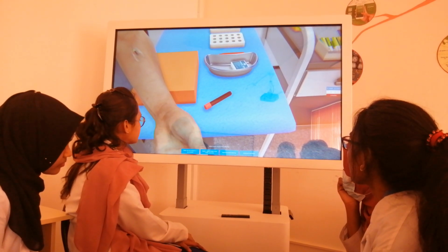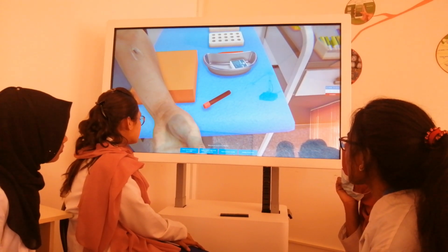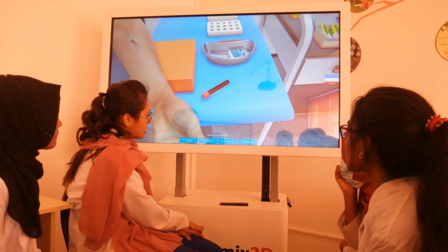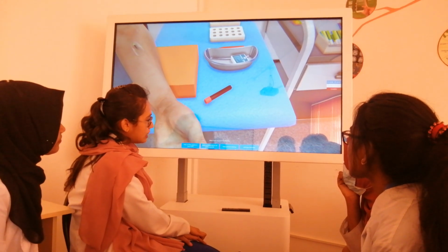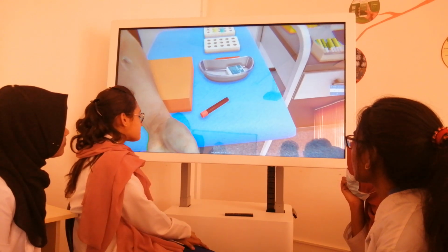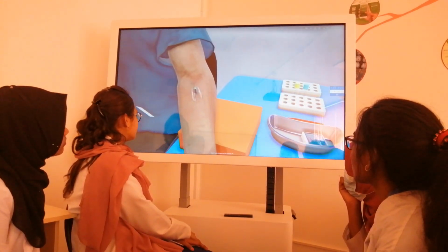What process should be the following? Make sure the patient is in good health. Apply an alcohol wipe to the vein puncture site. Apply pressure dressing. Labeling of test tubes. Apply an alcohol wipe to the puncture site.